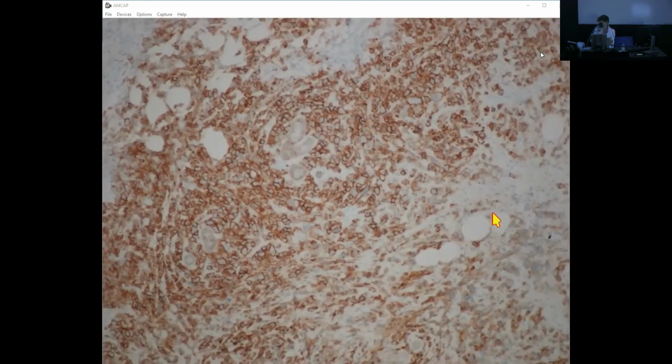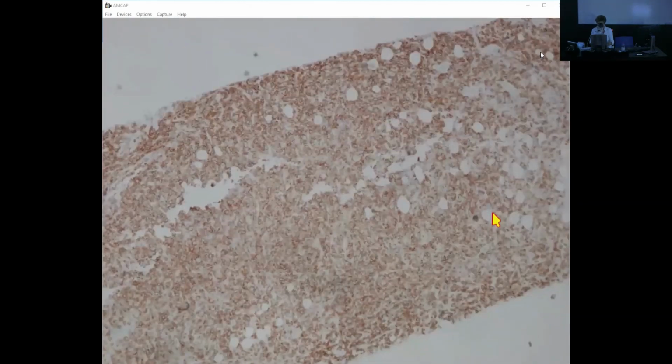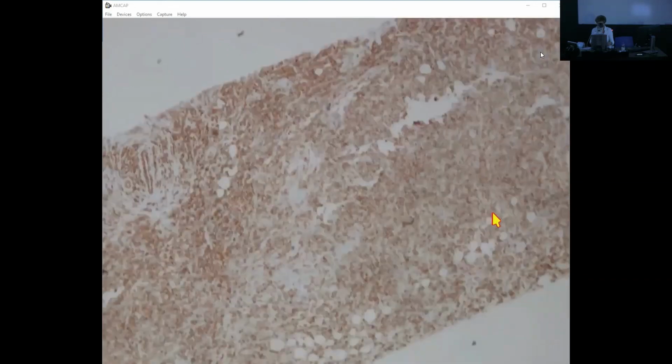This is CD138, and it stains. Once we realized it looked like a plasmacytic neoplasm, we did the appropriate stains and we amended the report, and it was cytokeratin negative. So again, the point is not everything that is in the breast is a breast carcinoma. Sometimes there are other lesions that can mimic it.